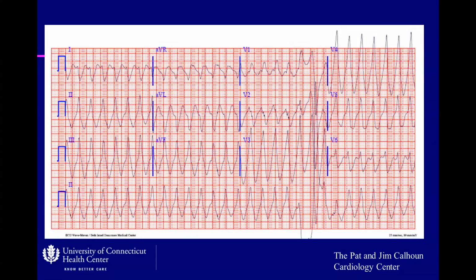I just have to have a cardioversion in a bit, but let's go through at least two more tracings. This is a wide QRS complex tachycardia, greater than 150 per minute, and it's right bundle morphology. The QRS duration is close to 160 milliseconds.